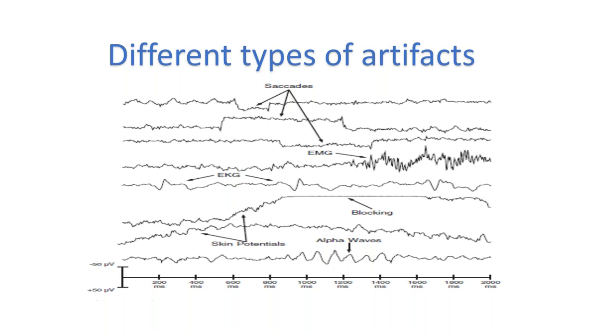The amplitude of these alpha waves is not much. The muscle artifacts and the ocular artifacts really have very high amplitude, whereas the alpha waves are not really high in amplitude. So even artifact rejection, whatever we use, will not really help us in reducing this alpha wave amplitude. They are generally less than 25 microvolts. So it is like an auditory evoked potential with very small amplitude.